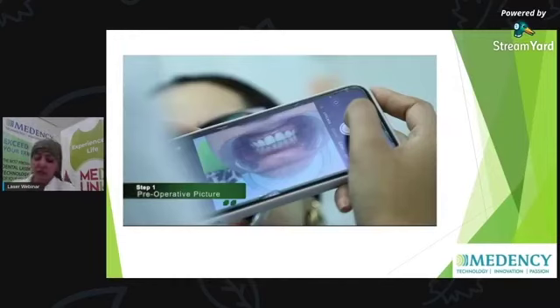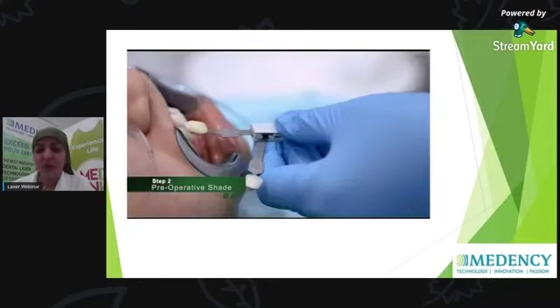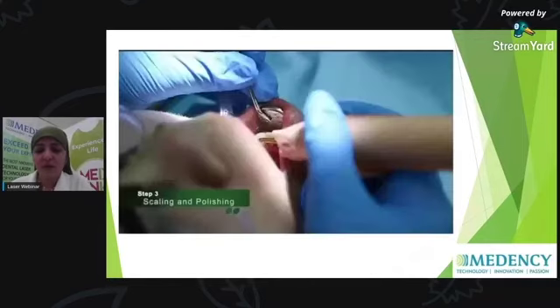Okay, let's see the steps. Step 1 is the preoperative picture for documentation. It's very important to document either your bleaching cases or your surgical cases. Any case you face in your dental clinic, you have to take a preoperative picture and a preoperative shade, and do scaling and polishing for sure before the bleaching.